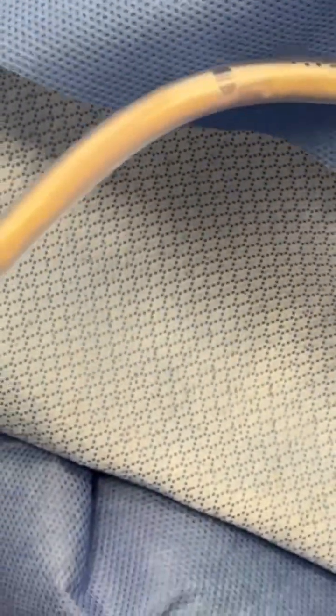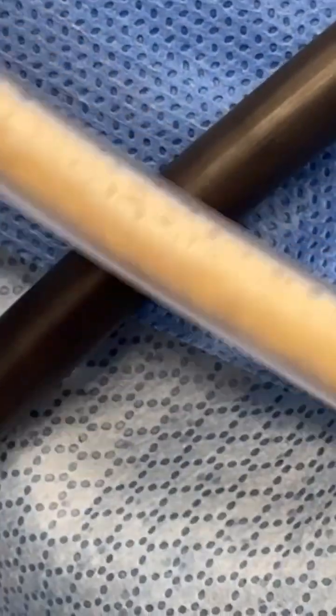And so look at this bloodless, oil-less aspirate, right? So if we don't put oil, there's not going to be oil cysts. If you don't put fat with blood, there is not going to be bleeding, right? And there is not going to be a reaction to that blood that you put in there. And of course, the fat graft retention, meaning what you get to keep, is almost 100%, because it's almost 100% what you put in here. It's all fat, right? Look at that. And we can do this consistently and all the time in all our patients. And I love doing it this way. It's really a very unique technique.